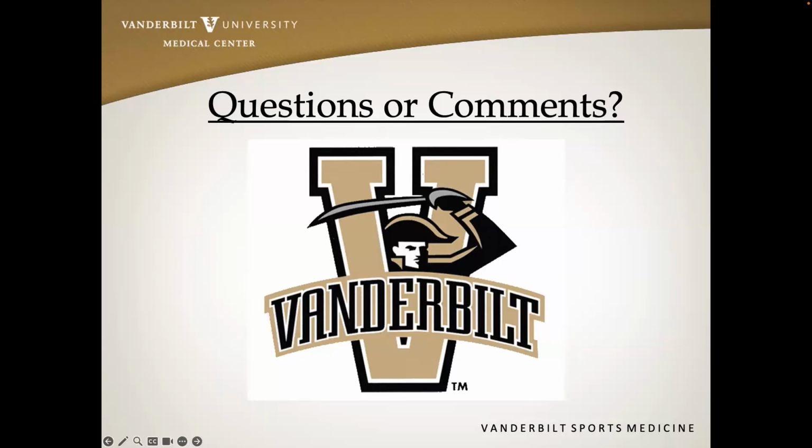So once again, as you highlighted in some of those findings, at those areas the non-ossified cartilage is going to appear hypoechoic, which is typically what we see with hyaline cartilage. And that can obviously be a normal finding as those patients are becoming more skeletally mature, usually in the later teenage years. So once again, it's about awareness of pediatric findings versus adults, and then those conditions that we can see.